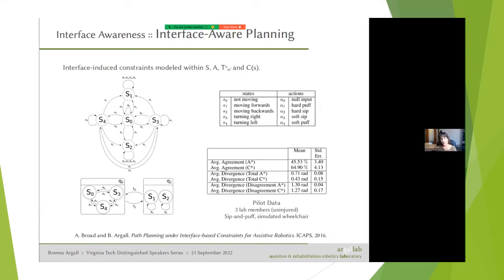So why would this even matter? You'll recall that in earlier slides, we're using this piecewise linear blending paradigm. So if you are able to choose an autonomy command that's closer to what the human was able to issue, you're going to better match what they're trying to do, potentially. That's the whole idea: if the autonomy is constrained similarly to the human, with respect to being interface aware, then when we merge their signals together, we will have less dissonance. The autonomy command will still be the safe command, if that's the reason why they're different, to avoid an obstacle, for example.